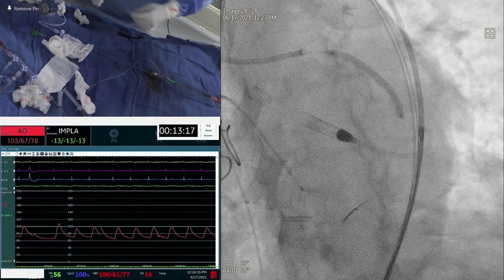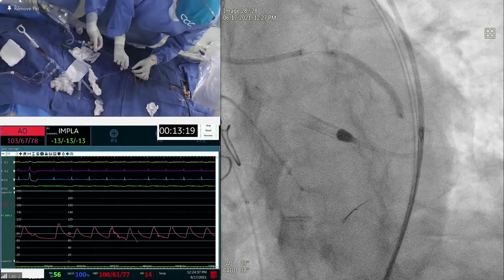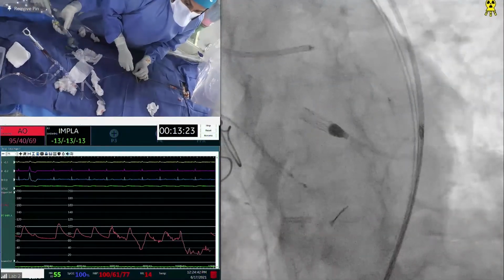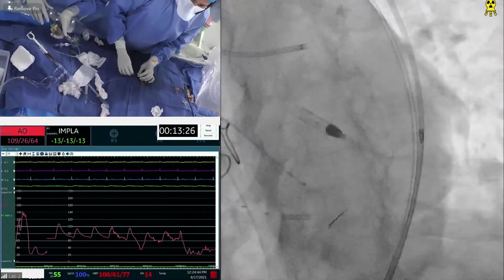I feel like this is a larger vessel than 3.0. Yeah, I think you're going to post dilate with a larger 3.0 balloon. 3.0, maybe 3.5, I will see. Okay. You want to decide if you need a stent? Let's take a picture. Ready? Yeah, I need one.